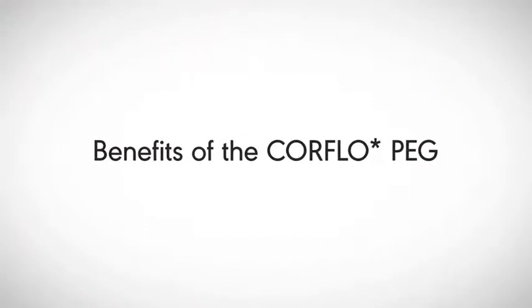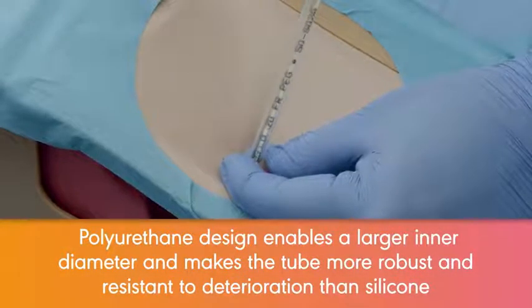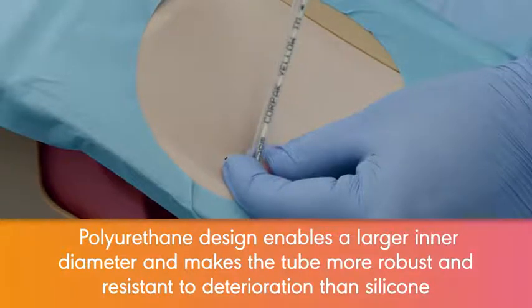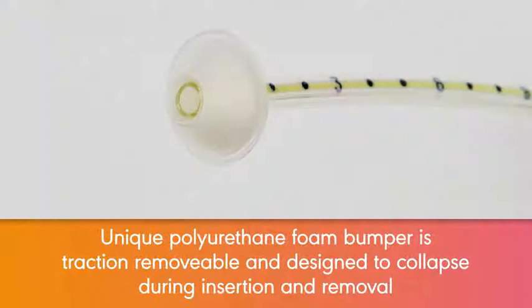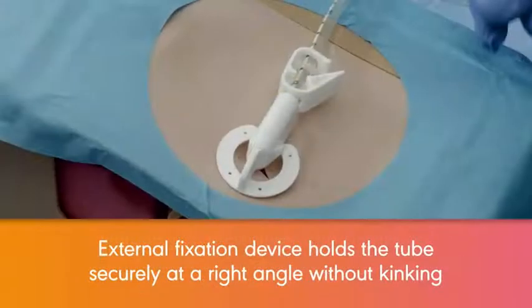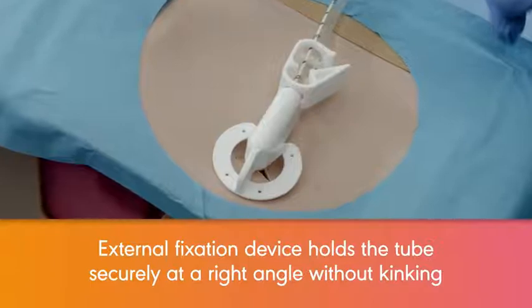The benefits of the CoreFlow Peg are: the polyurethane design enables a larger inner diameter and makes the tube more robust and resistant to deterioration than silicone. The unique polyurethane foam bumper is traction removable and designed to collapse during insertion and removal. The external fixation device holds the tube securely at a right angle without kinking.